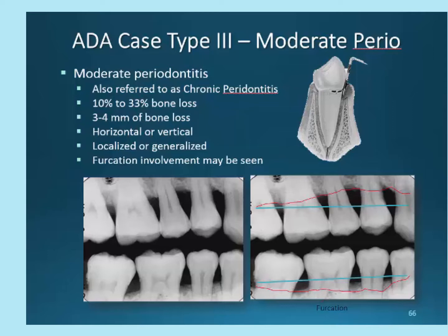You may not have seen exposure of furcations in your periodontal course, but we will introduce the condition to you in radiology as it is a definite sign of this classification when visible. Furcations are areas on the tooth anatomy where the root begins and the coronal part of the tooth are associated.